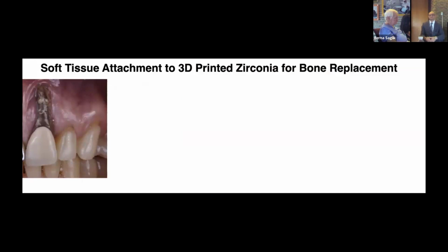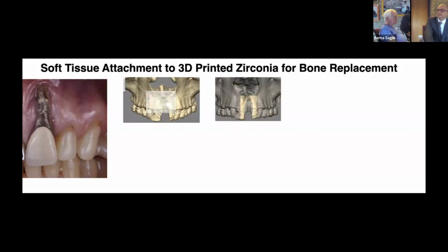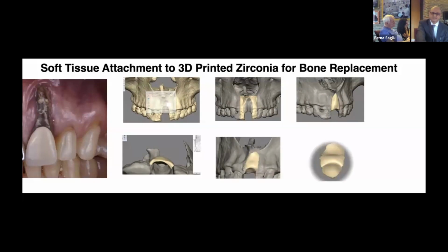So basically in those cases, you send it to a surgeon, they do multiple grafts, you know, bone grafts, and try to get it. Sometimes they can, sometimes they don't. But another idea is that you can really replace that missing bone. You can take a cone beam CT scan, and the same way that you design it, you can design that piece of bone with the shape of the missing one and extract the STL file. You use a material that's out on the market, that has been approved by the FDA as a device. They have a different FDA application for that. And then you print that with a specific surface texture.